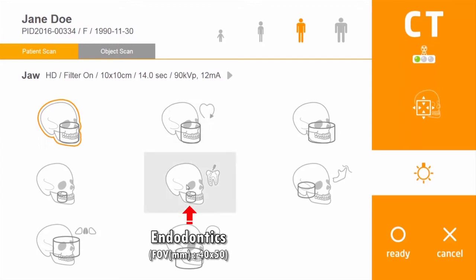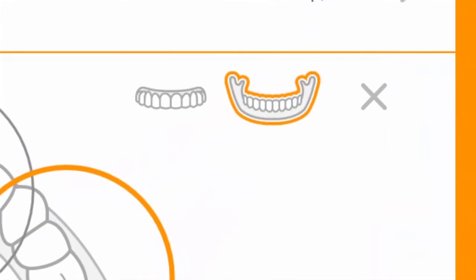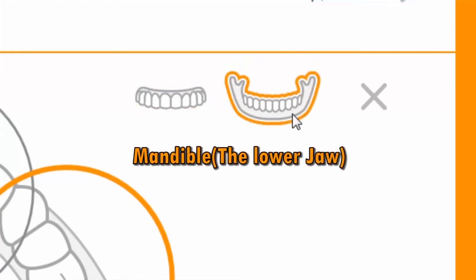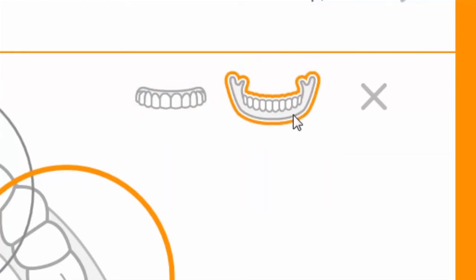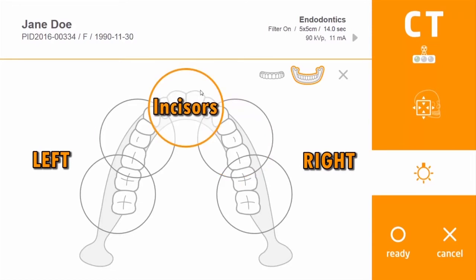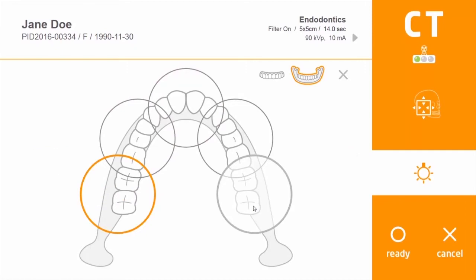Click the endodontics protocol and select the desired area for acquisition. Go to area selection and select the maxilla or mandible icon. Next, go to arch image and select the area you want to scan. There are five different tooth areas: incisors, premolars, and molars area.